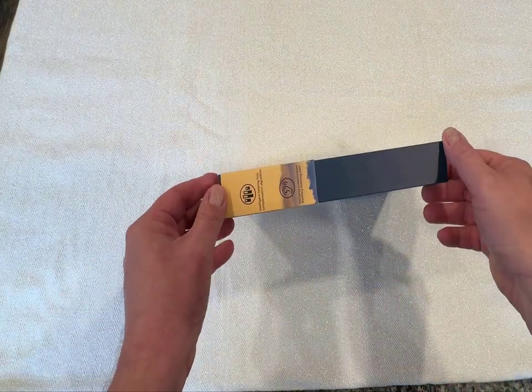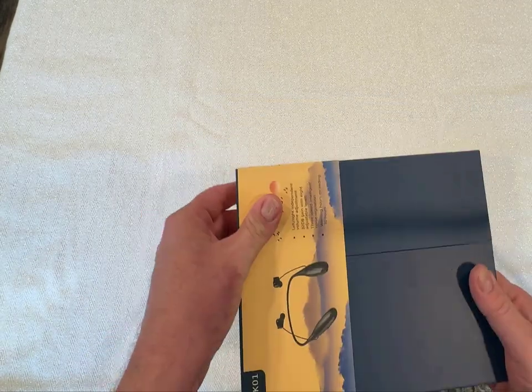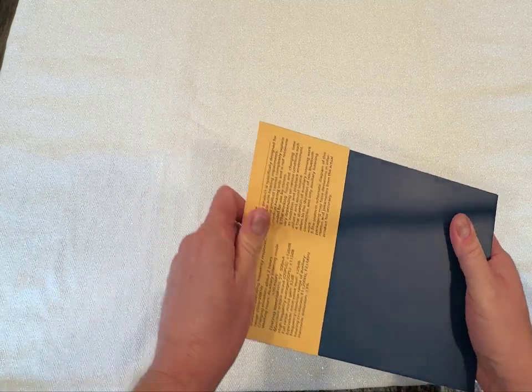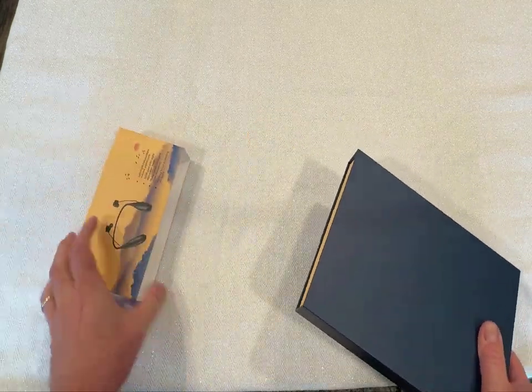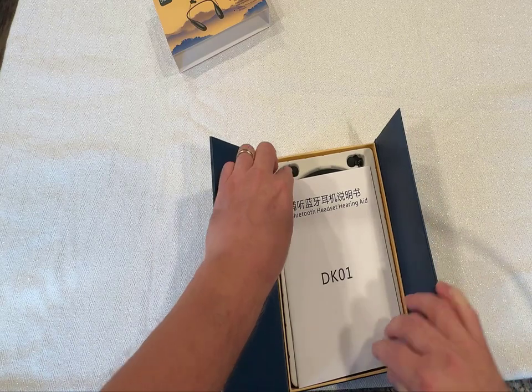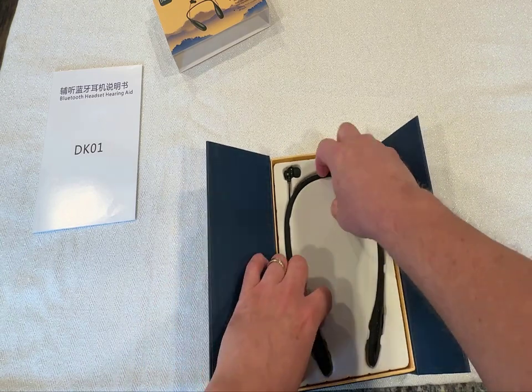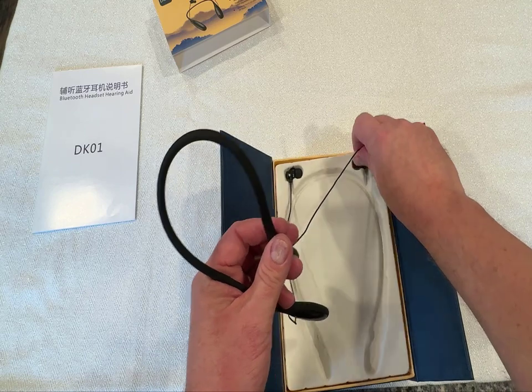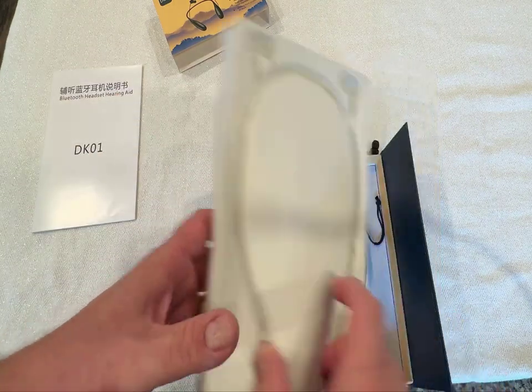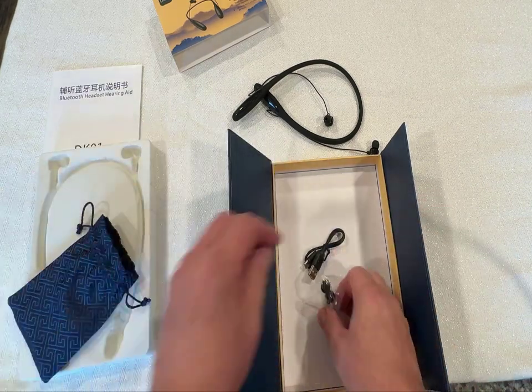Here's a quick look at the DailyTop DK01 Rechargeable Hearing Aid that I received for review. Here's what's in the box. It comes with a USB charging cable and spare earplug covers.